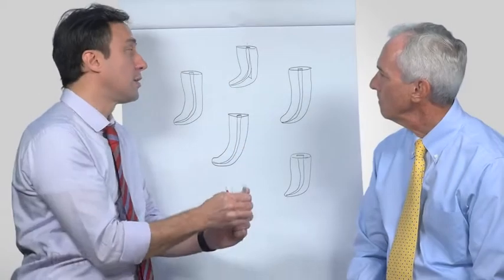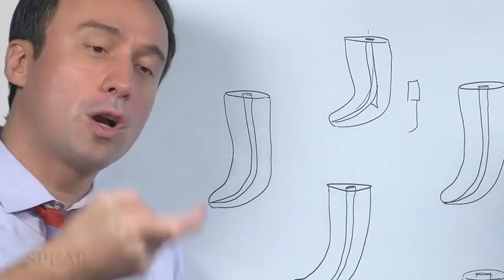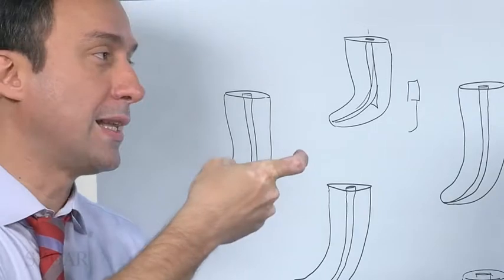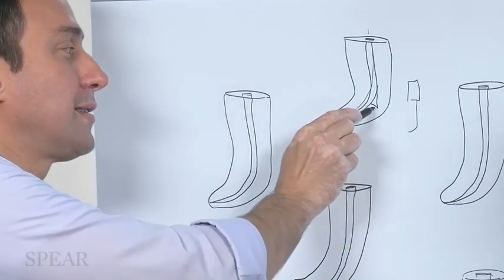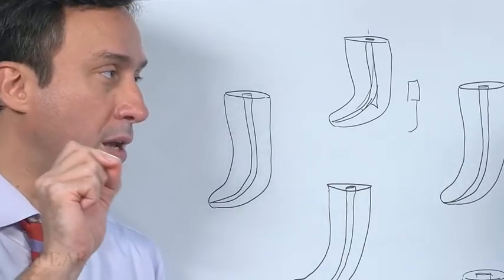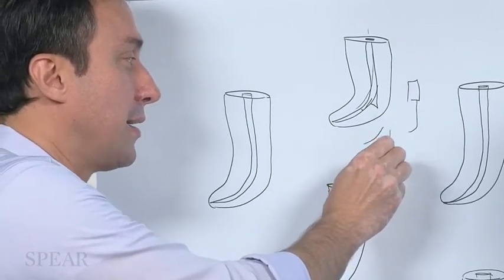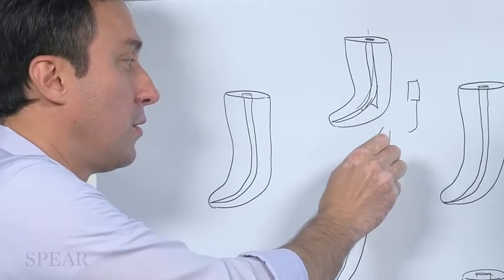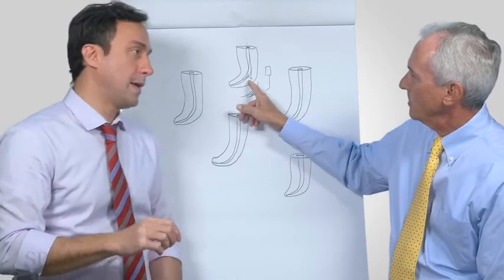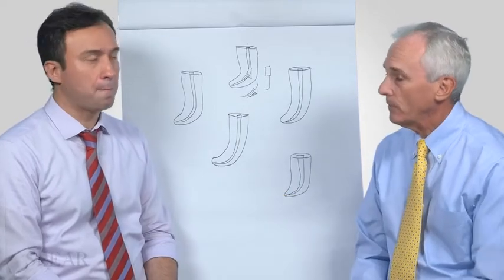If you do get a ledge, the trick would be to put a hook on your hand file, then work it down, and the hook will act like a little bit of a scouting tip until you can basically get it past. The goal is to get past this little step, this ledge, and back into the main canal. When you get in there, then you just have to go in short amplitudes up and down so you can remove this little step that you've created like this and make it smooth this way. So the goal is to make it smooth, get rid of that so that you can then go back. If you get past that ledge, don't remove it. Stay until you've enlarged it enough. Yeah. A lot.